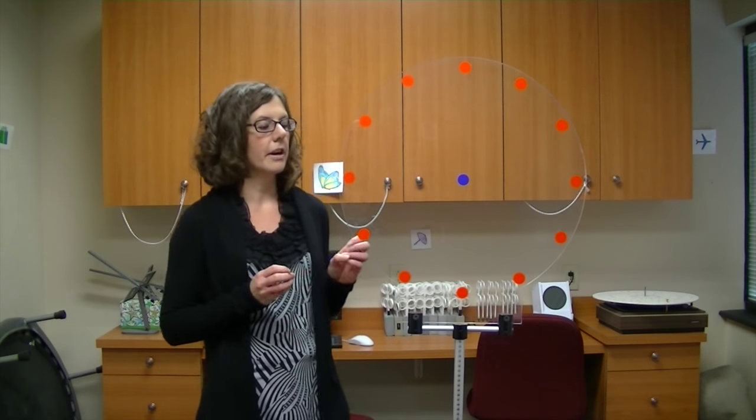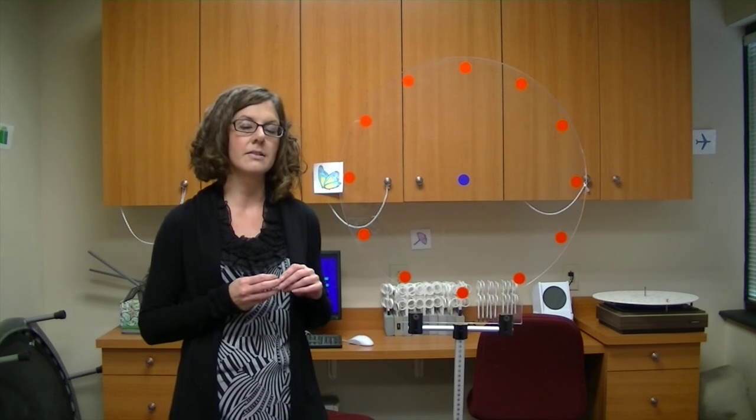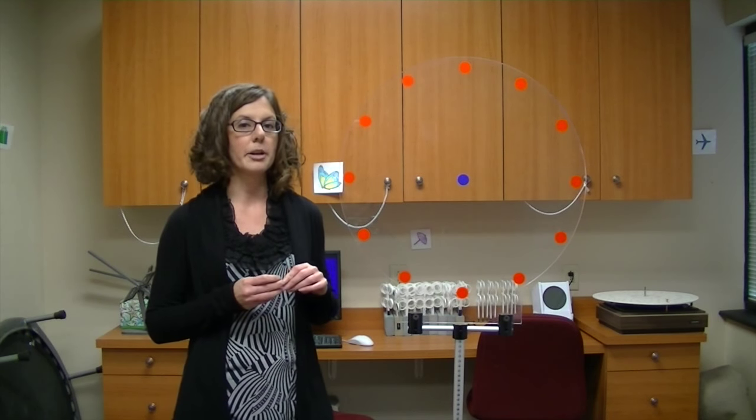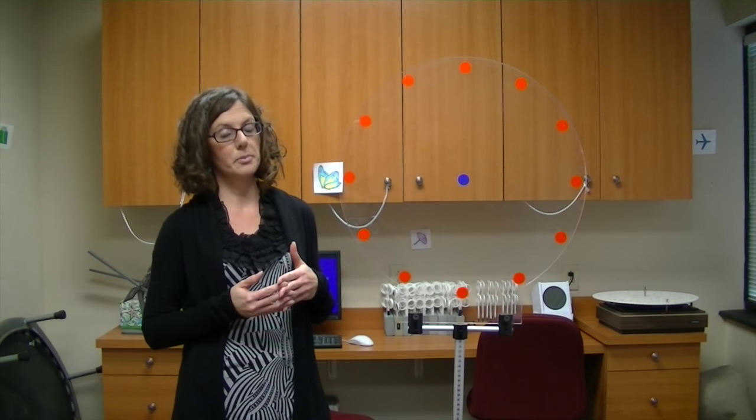This is an instrument that we utilize in vision therapy quite often, and there's a lot of great little things that we can do with this one. It helps to train things like better tracking skills for reading, also better location skills. That might be just awareness of surroundings. It might be reading, but it also might be with sports.